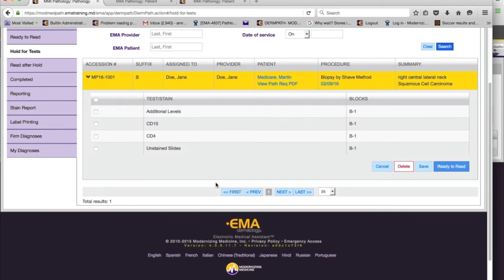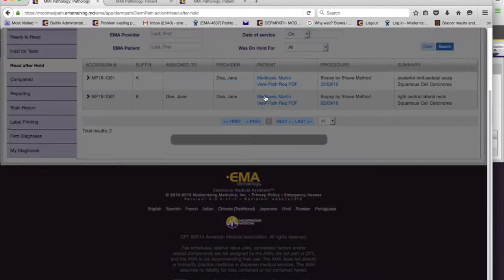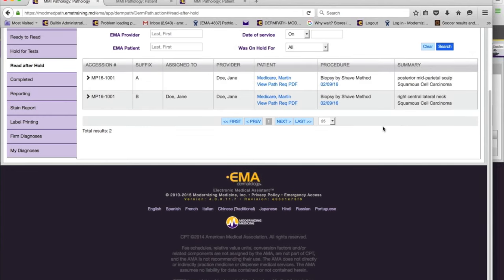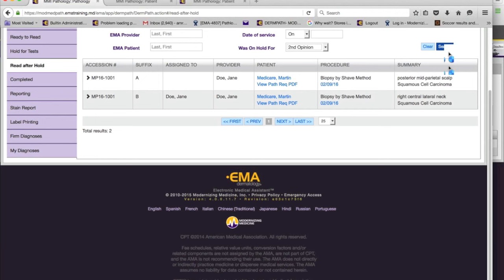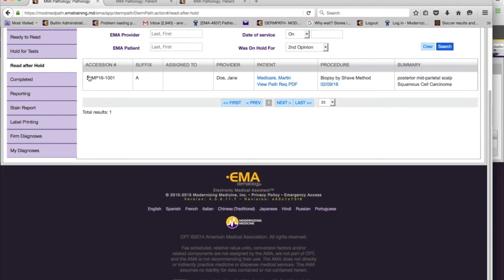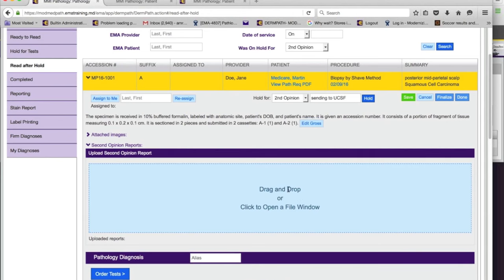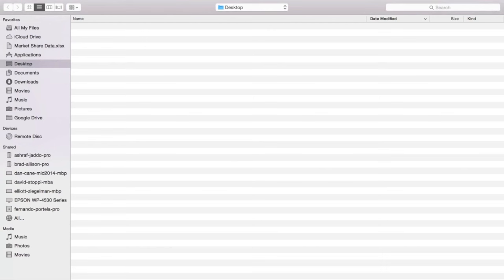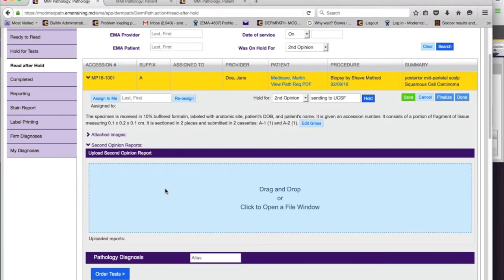The lab opens the case, sees the tests to be done, creates the slides, and when ready, sends them back to the dermatopathologist to read. They can delete tests if ordered by mistake, then mark as 'ready to read again' when done. The case held for second opinion lands in the hold screen. You can filter by why it was held — for example, filter by 'second opinion' to find that case. When you open it, there's a place to upload the second opinion report so it becomes part of the case.